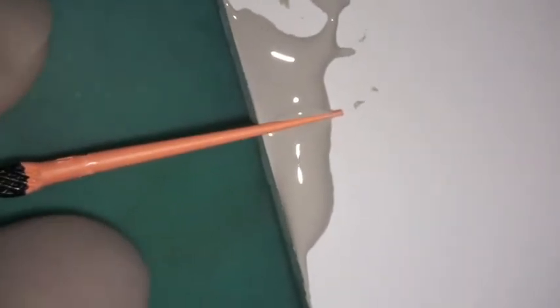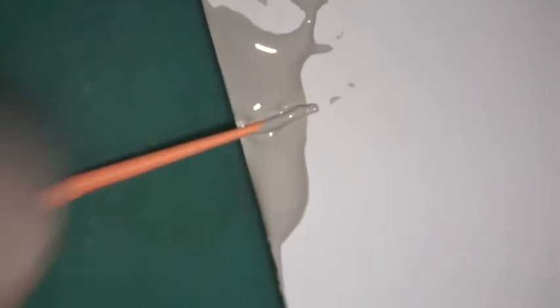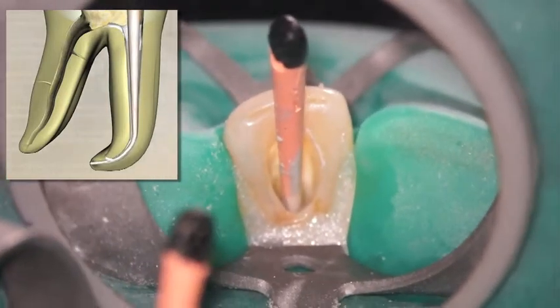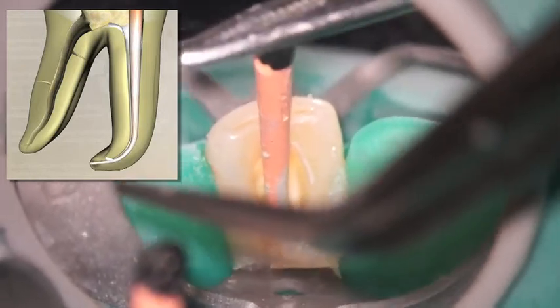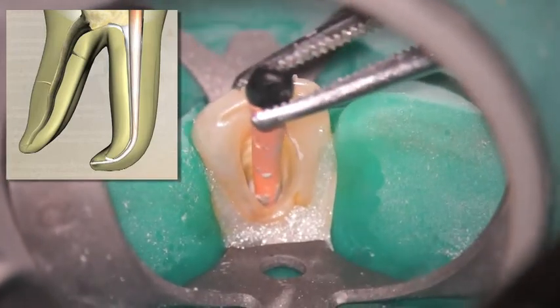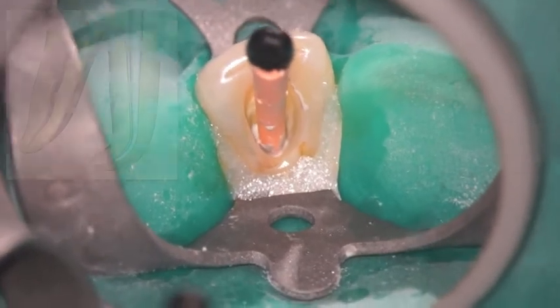Here's an illustration of using Kerr Extended Working Time Sealer. I like to mix that to a certain consistency and then place my gutta percha cone right on the edge of the mixing pad so that I can literally roll it, making sure it's circumferentially all the way around the gutta percha cone. What I'm trying to show is that instead of placing sealer in the root canal system with a paper point — which sometimes leaves little bits of paper fibers — I like to place my sealer in there with a cone that I refer to as a sealer cone.